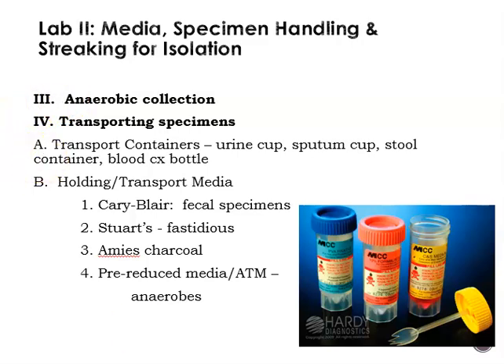As far as transporting specimens goes, like I've stated a couple times already, we must be able to keep the cultures alive until they can be tested. So ideally, specimens should arrive in the lab within 30 minutes of collection. That's not always possible, especially if it's a home health situation or an outpatient type situation. Preferably within 2 hours. If not, then the specimen needs to be properly stored or preserved.